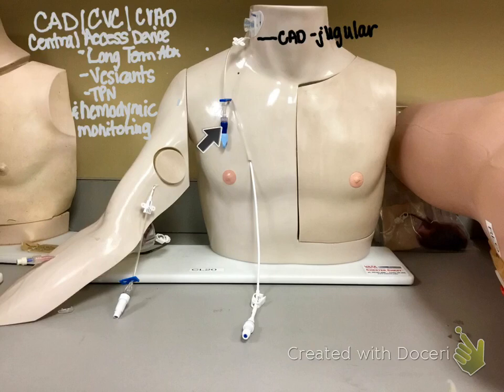And this other cap is a positive pressure cap, and that used to be what they put on there all the time. It just prevents the blood from backing down. So it's positive pressure, so it keeps the blood from just filling that up. Sometimes if you have a good blood flow or bounding pulse, or patients moving around a lot, you will see a little blood back up, but most of the time you won't see it all the way to the end because of this cap.